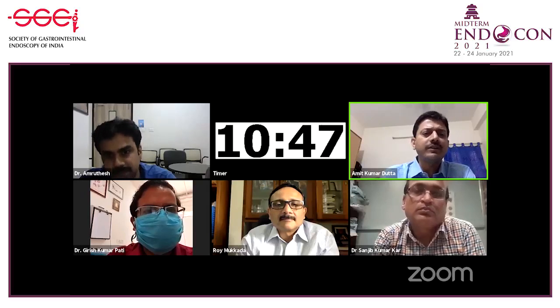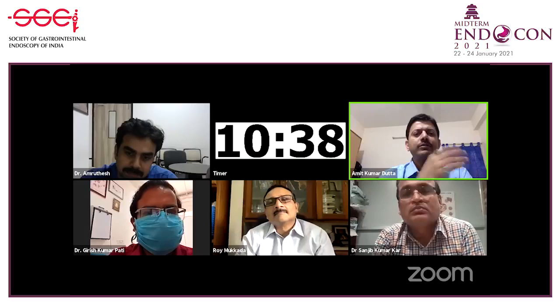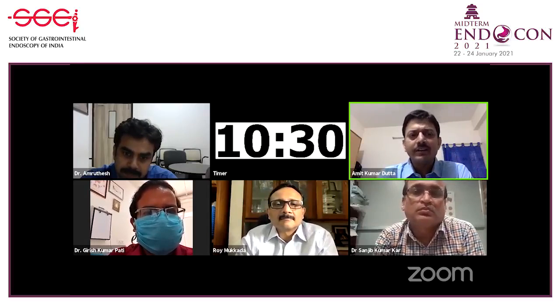So there is a huge amount of interest in artificial intelligence, and I think it is just a matter of time before it becomes part of the routine software package of image enhanced endoscopy. That is definitely going to be the thing of the future. Application will increase once people can use it with the assistance of artificial intelligence to know what lesion they are seeing. Right now it is not ready for prime time, but a lot of work is being done, and I am sure it will soon be available.